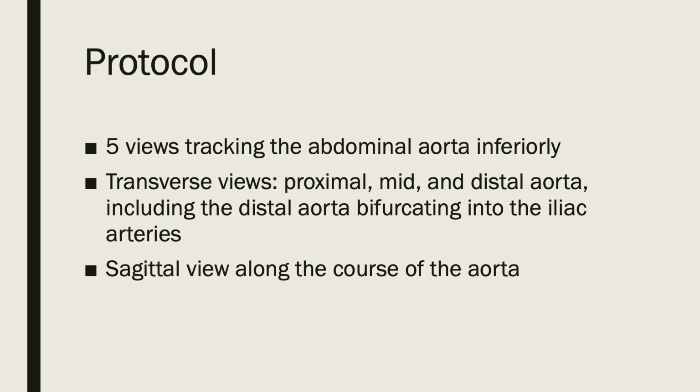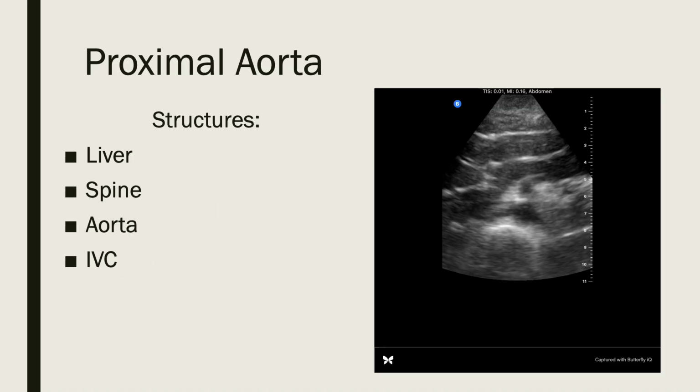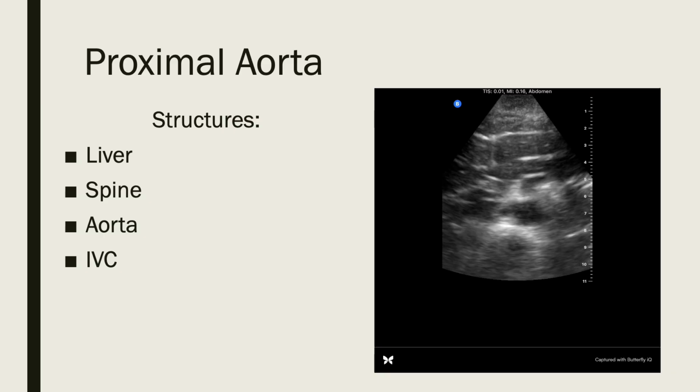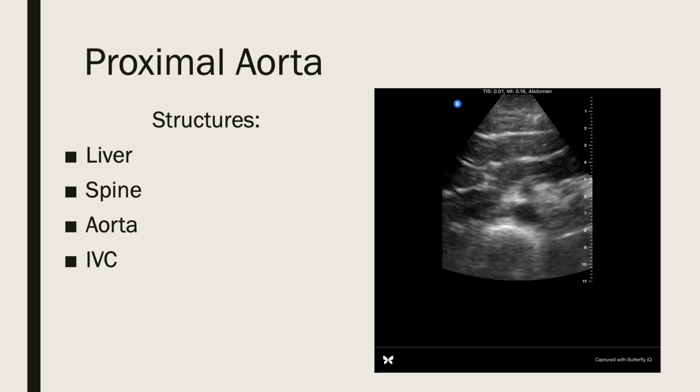So let's review some images from a screening exam I conducted on a patient using a handheld Butterfly probe. I just want to note I gave myself about 3.5 minutes, give or take, to conduct the entire exam. It's a little bit of a specific amount of time, but I'll explain why I chose that a little bit later.